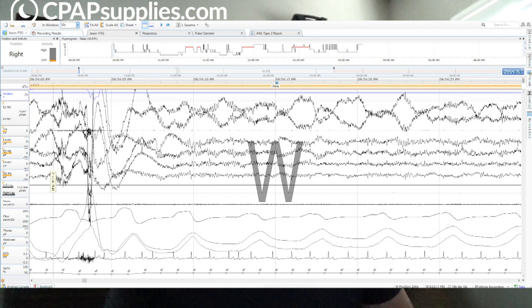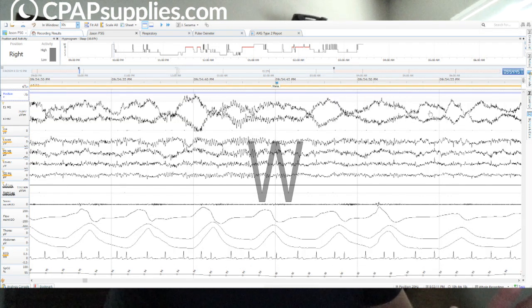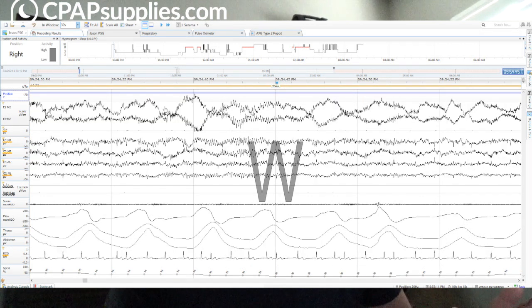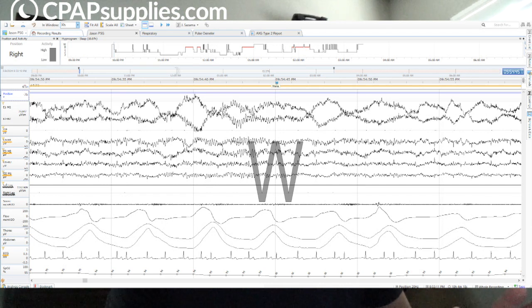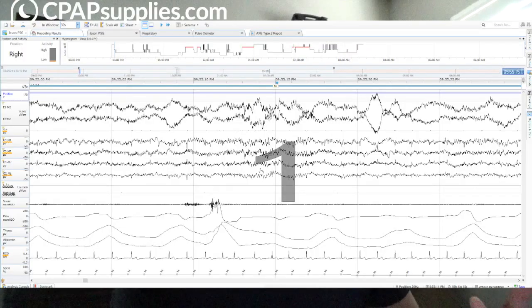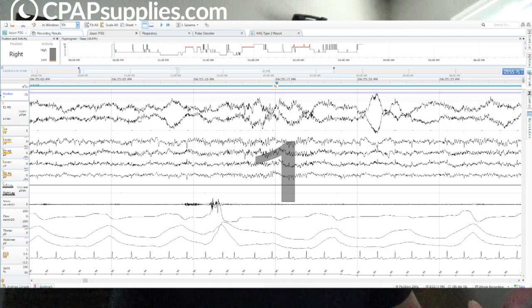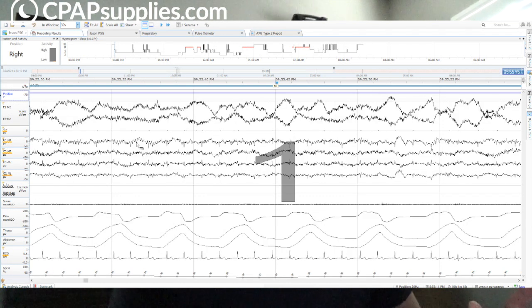It is now mixed frequency low voltage, which is close to stage one, and slow rolling eye movements. This is stage one right here. We have a brief period of alpha activity right there, but this side is stage one. I screwed up. I made a boo-boo. So now we have stage one, mixed frequency low voltage, slow rolling eye movements.